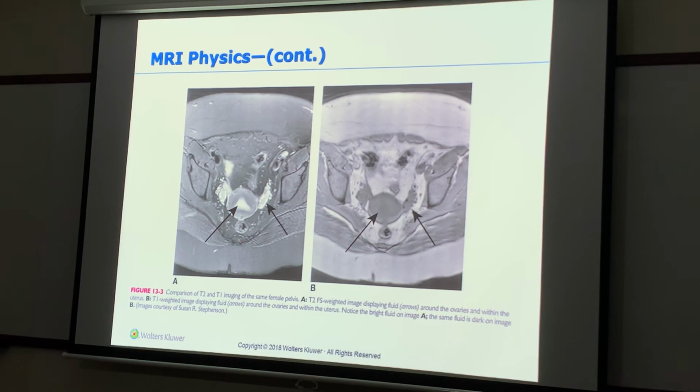Can you explain more about the fat saturation? Yes. Okay. So I can program my machine. FS is what the button says. And what it can do is it can separate the fluid from the fat.